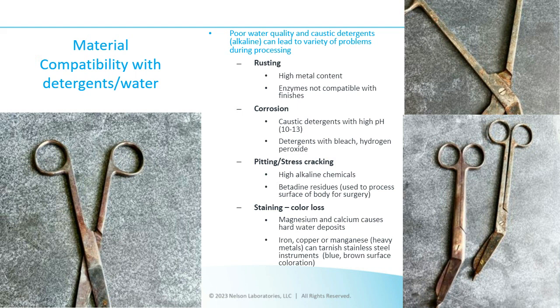Although we're using utility water for cleaning, the last cleaning is done with RODI water. And even with the last rinsing with RODI water, over time, this is what it's done. So it's just something to keep in mind, that the water that you use for cleaning your devices is very, very important. We in the lab will make sure that we're using the right water. The manufacturers have to make sure that when they're selling their devices to the hospitals, they have the right water quality for your product.